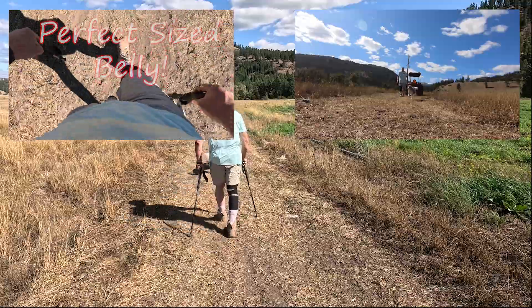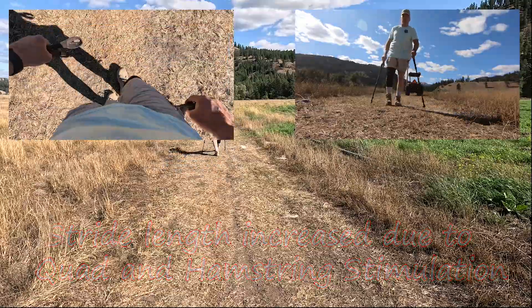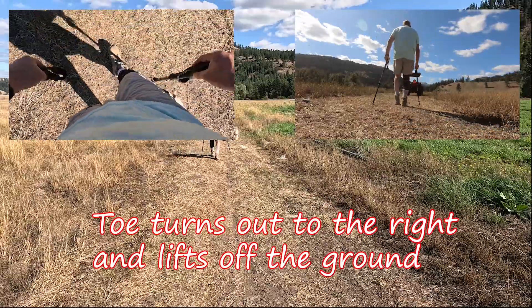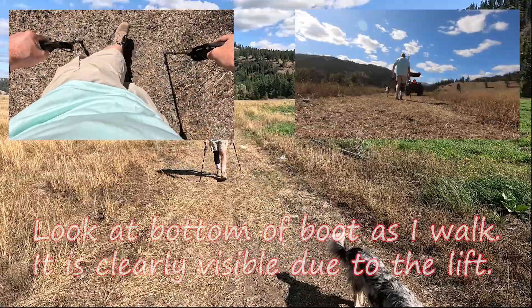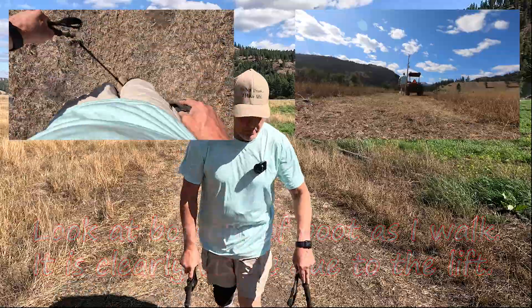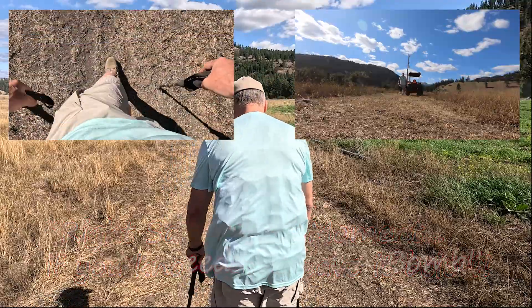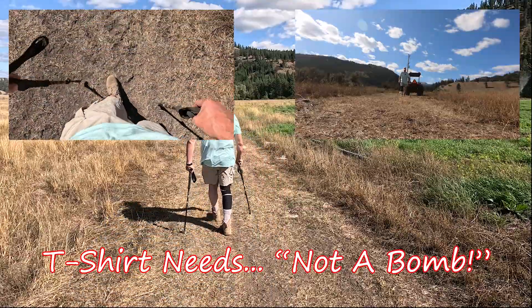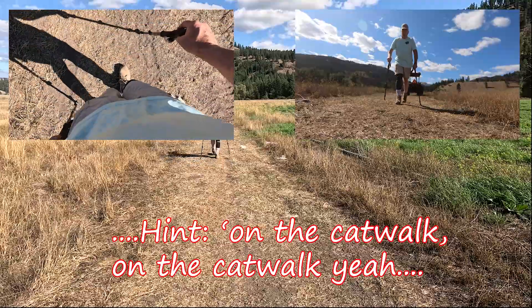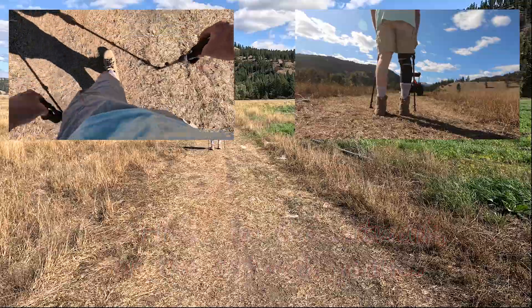Now look at my foot. Longer stride. My toes lifted up — that's in response to the electrical charge that I'm getting, even walking into this wind. It's pulling up and over to the right, and that's the way I have it programmed right now. You can change the programs on the fly through the app, and yes, I do have a video on the app. Once again, this is rough, uneven ground, but I'm not leaving a trail and I'm not puffing up dust as I walk.